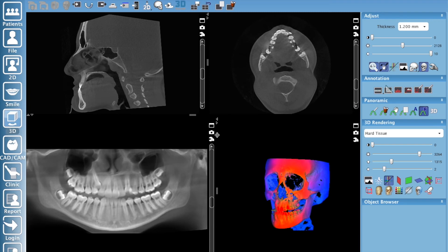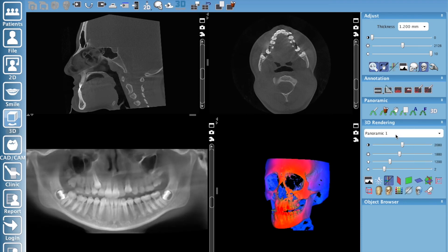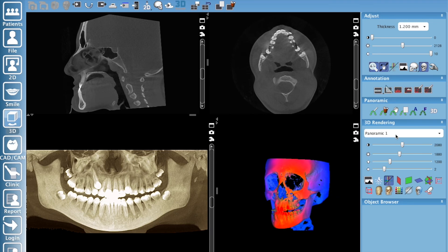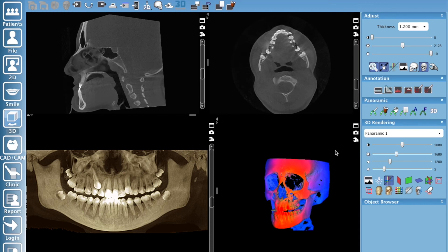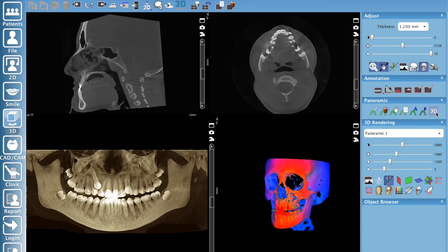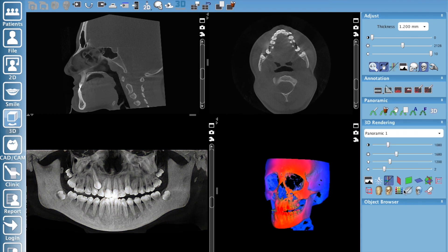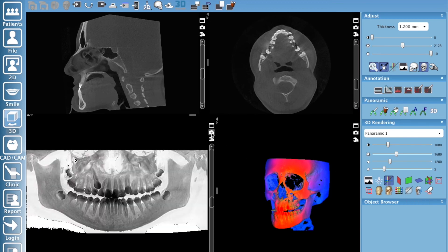Another cool thing you can do to take it to the next level: under panoramic on the right toolbar you've got a render mode. Click that and you've got several different rendering options. Your software probably has MIP, which is fantastic — click on that and it creates a really cool effect. You can adjust your brightness to make it look a little nicer. That is a pretty cool panoramic view that everyone's starting to use nowadays. There's also a new MIP black and white option coming out — really cool look. Take a snapshot of that.